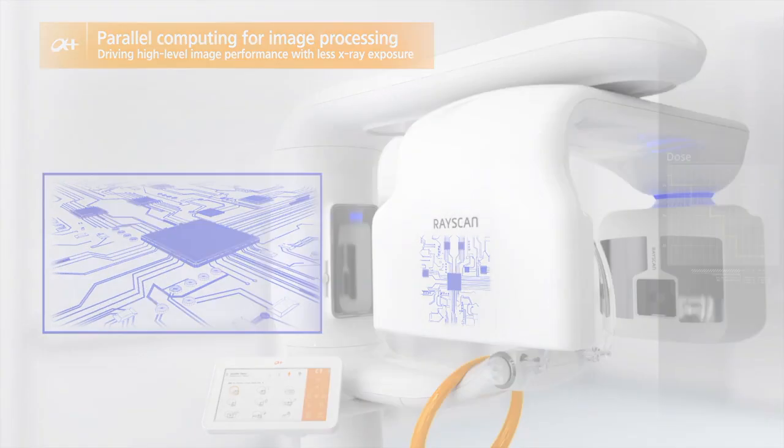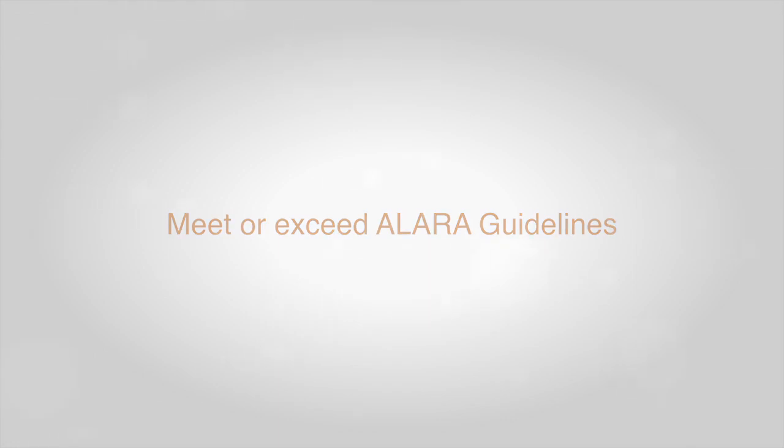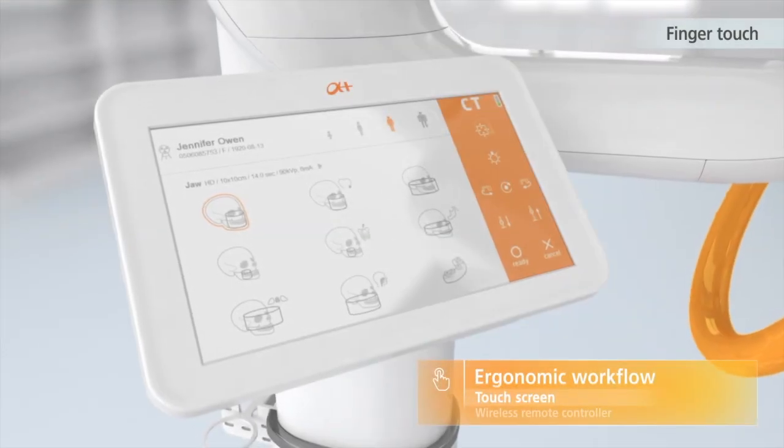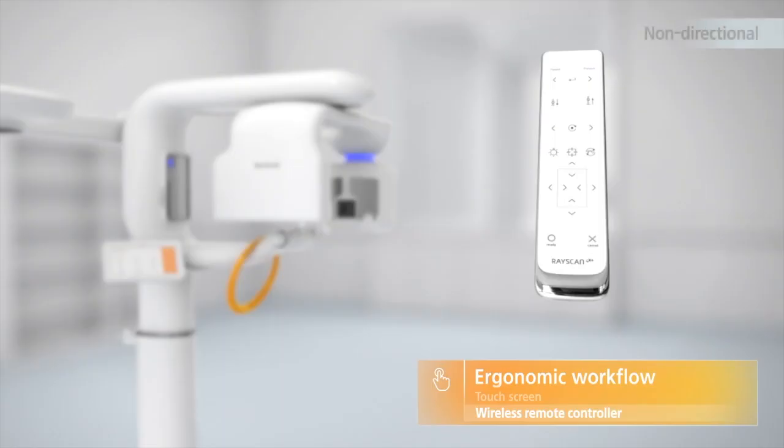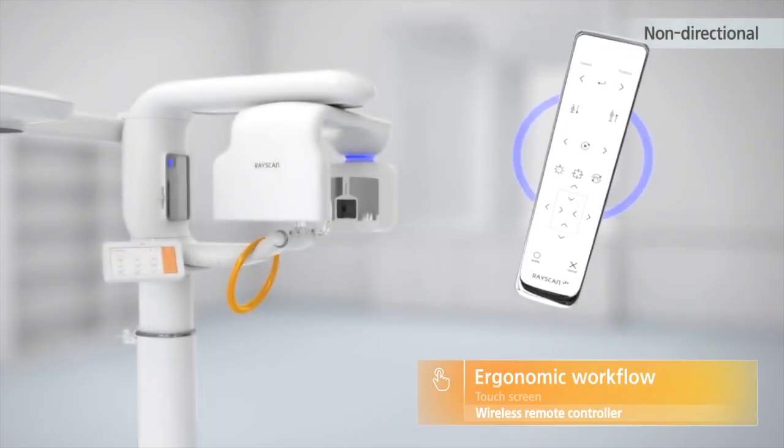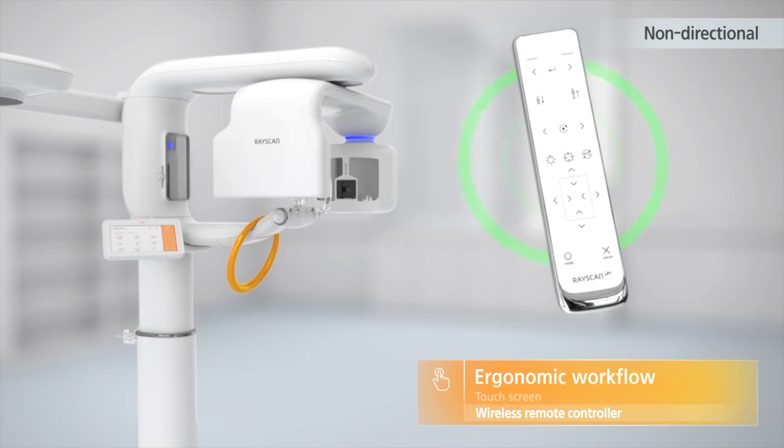The RayScan Alpha Plus offers an intuitive workflow, shortening the learning curve for your team. The wireless remote control allows you to move freely around the patient while positioning them.